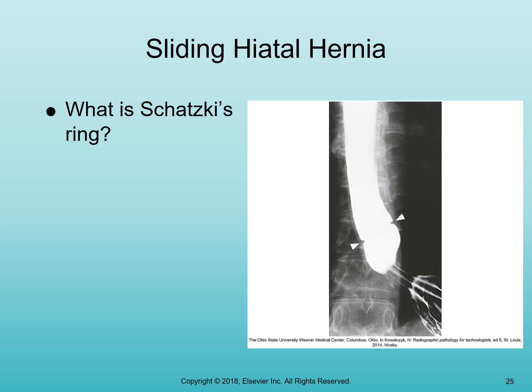A sliding hiatal hernia, meaning sometimes the hiatal hernia is present, maybe when the patient's laying down, and then when the patient stands up, that sliding hiatal hernia actually goes the opposite way, and you're not going to visualize it because that portion of the stomach would be below the diaphragm.